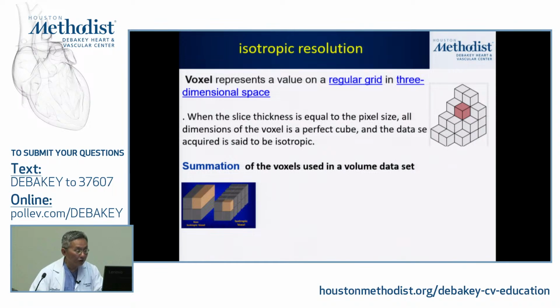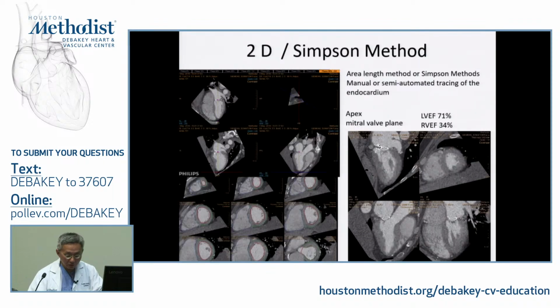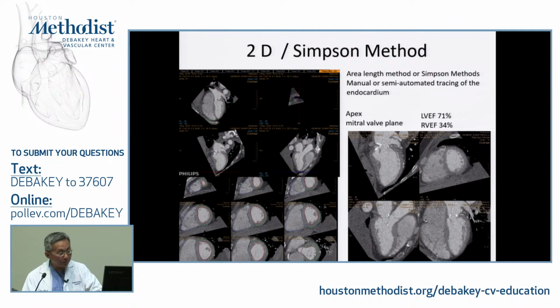And the cornerstone of the technique is isotropic resolution, okay? In all 3 dimensions, we have a spatial resolution of 0.5 mm with a newer scanner. Technically, they're talking about 0.25, close to the LV angiogram, but we gotta see that. All 3 dimensions, so essentially what allows you to rotate and really calculate how many voxels in each structure. Essentially, a voxel is the volume in 3-dimensional space, and all the same, with all the same spatial resolution.